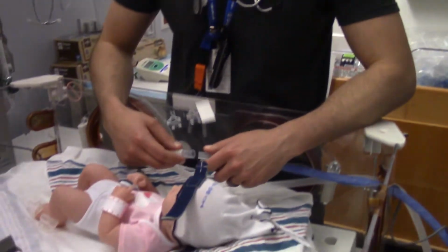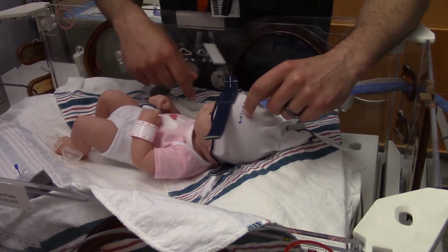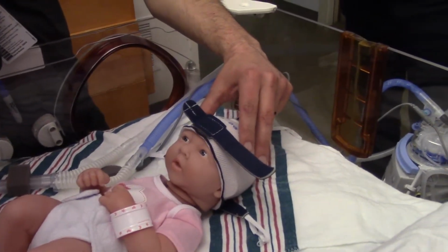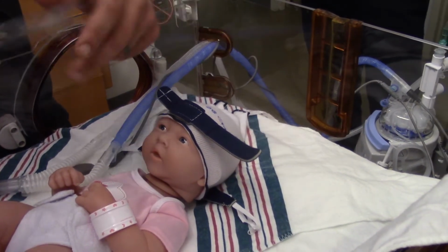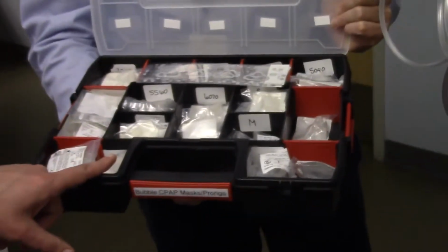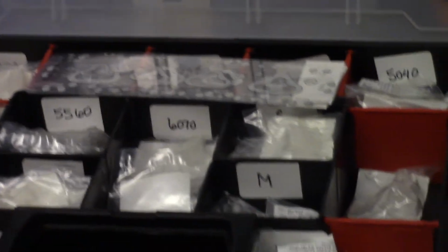Next step, now that we have our trunk, we've determined what size we are going to use, we're going to determine the size of interface we're going to use. So just by looking at this child, we see a pretty small nose. So it would be logic of thinking, okay, let's grab a small, maybe a medium mask. These little tools come in every trunk container. Each one of these is in here, and we also have them in our CPAP mask prongs container. It's like a little toolbox for CPAP.